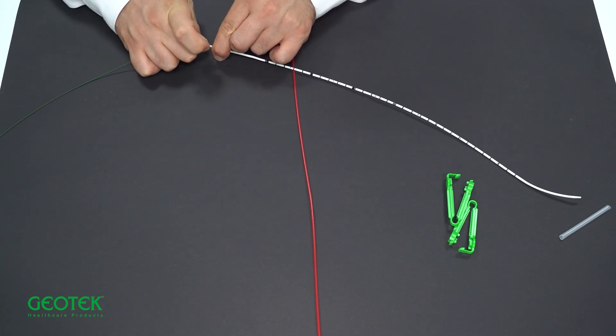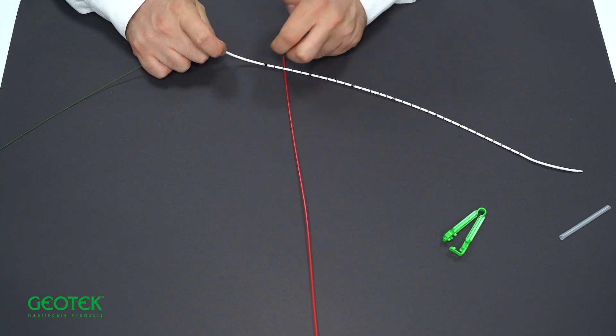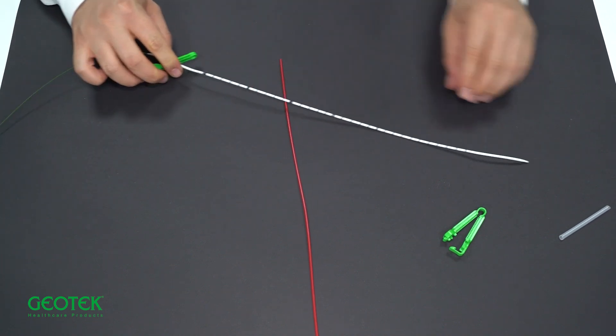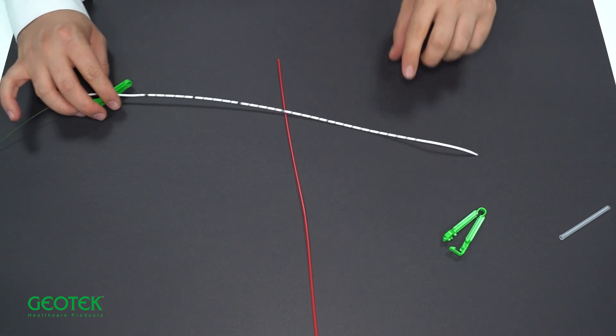When it is flattened, sometimes a second hand may be needed here. When we place this clip by stretching one side, this stent will become flat and suitable for use.